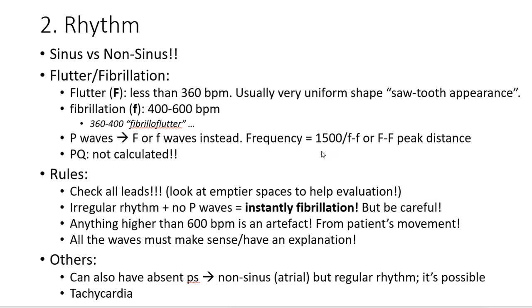Again, I have to highlight that when you write down point 1, we said it is based on action, mentioning the extrasystoles, and whether the action is regular or not. In point 2, you have to mention whether it is sinus or non-sinus, and if it's non-sinus you have to highlight whether it is flutter or fibrillation, and write the rate next to it.